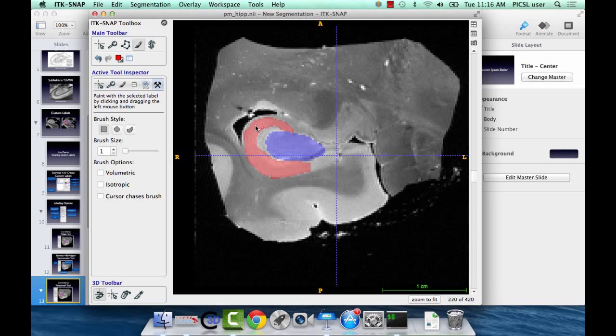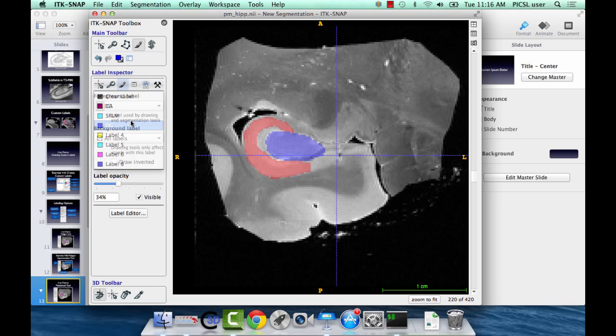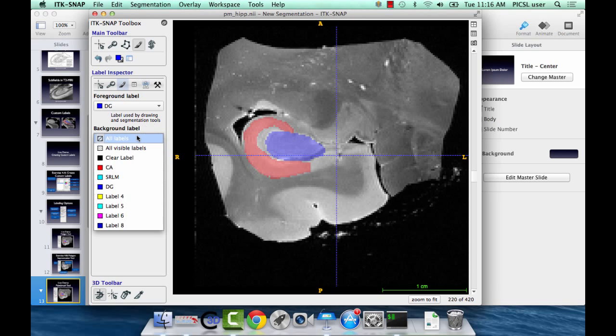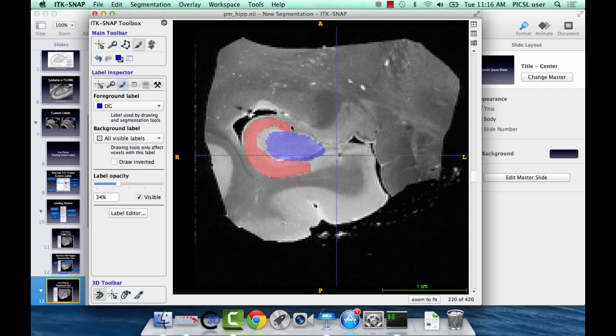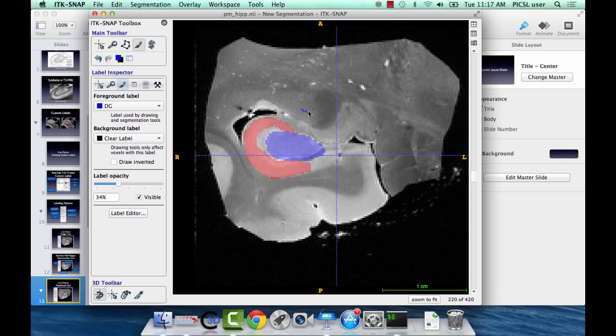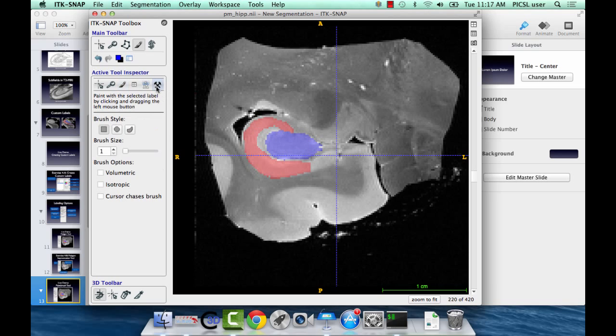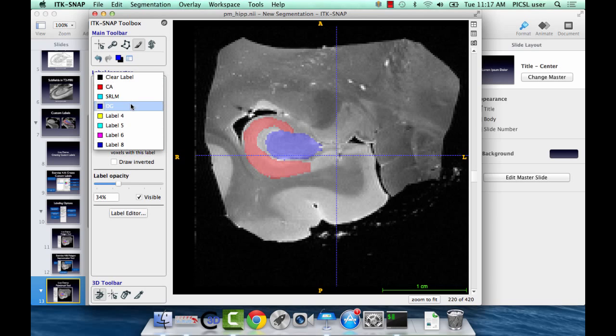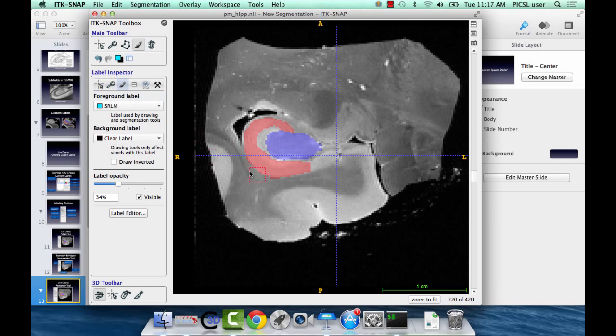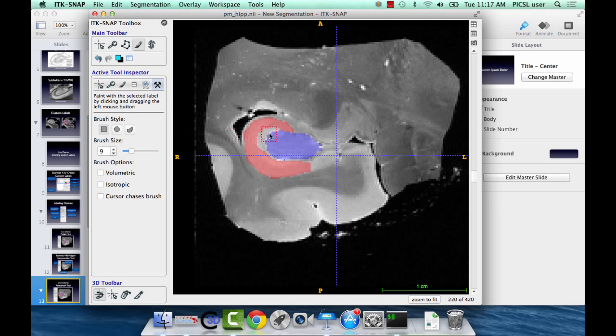It's a good tool for doing these very detailed parts of the segmentation. Say I want to fix up my dentate label, but I don't want to accidentally draw over CA. So, I'll only draw over clear labels. So, I won't draw over visible labels. So then, see, it doesn't affect what I've already drawn. If you have a mouse, you can draw with left click and quickly erase by just holding right click. And there's some other features. So, the brush size affects how big the region is. For instance, if we wanted to add the SRLM in between these two regions, we could set the background to clear so we don't overwrite anything, select a big brush, and then just fill this in quickly.